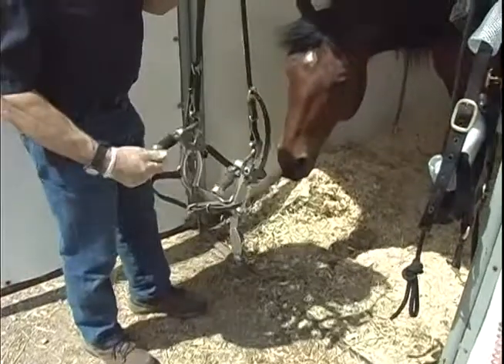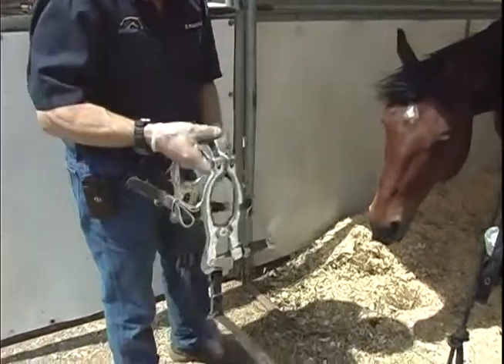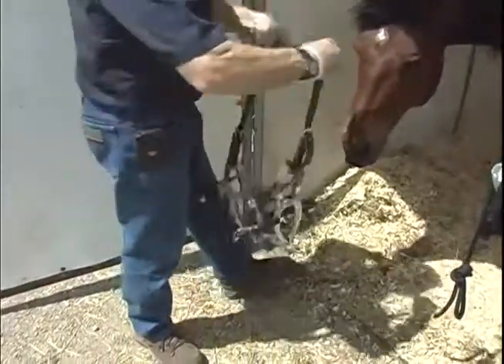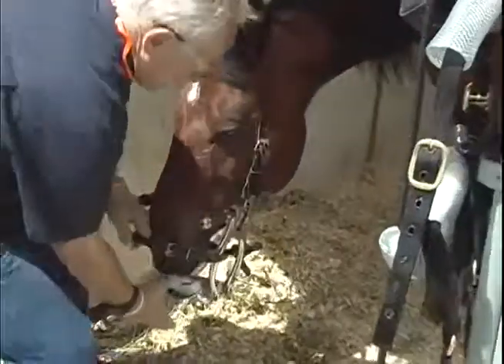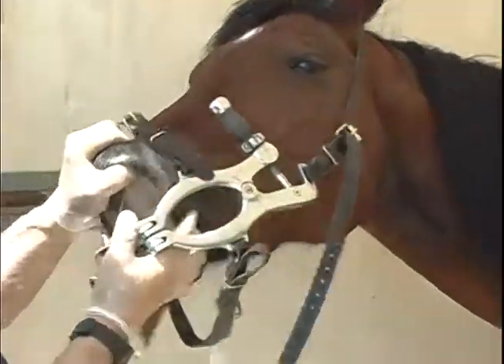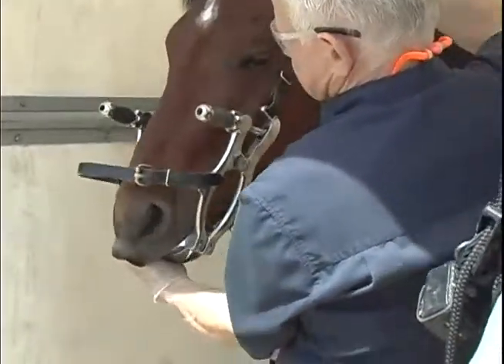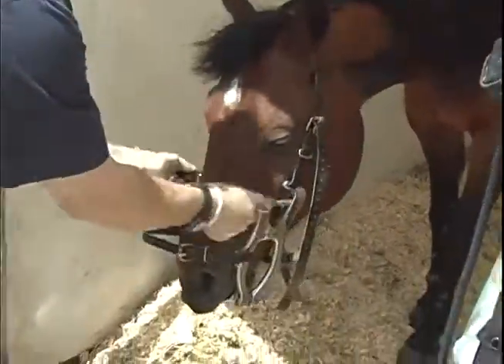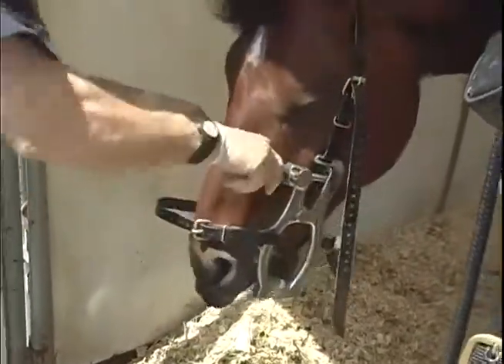This is the speculum with the turning handles. The handles open it up by turning inward and close it by turning outward. I like to use the turning handles in the up position. So I simply install the incisor plates, step over here, tighten up the speculum. Standing in front of the horse, it takes around 35 seconds to open the speculum.